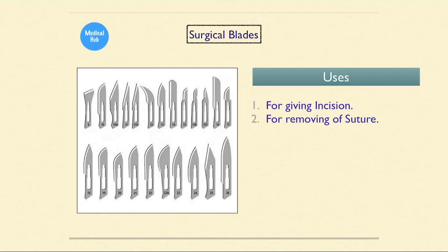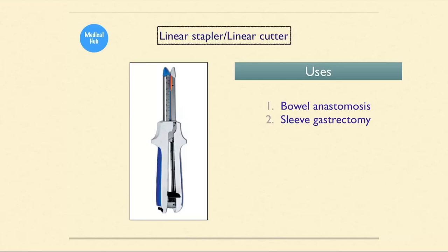We start with surgical blades, which are used for giving incisions and for removing sutures. Next is the linear stapler or linear cutter, used for bowel anastomosis and sleeve gastrectomy.